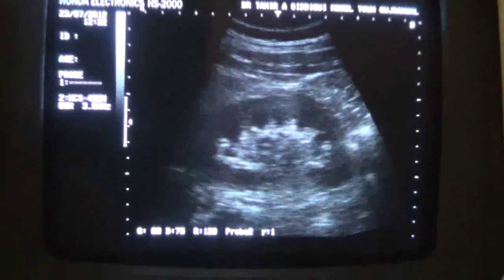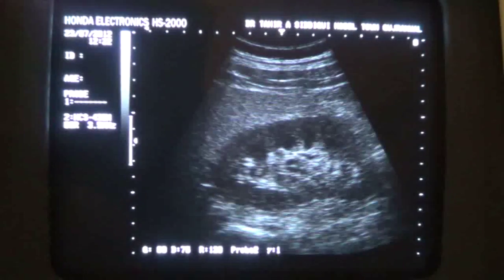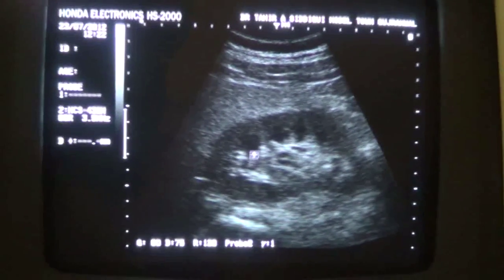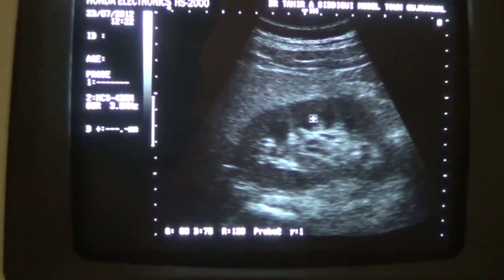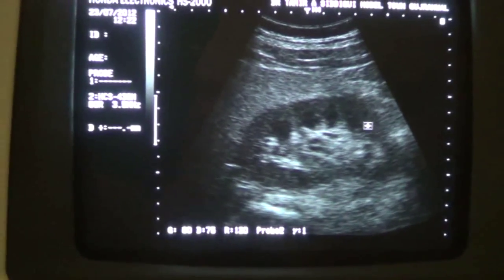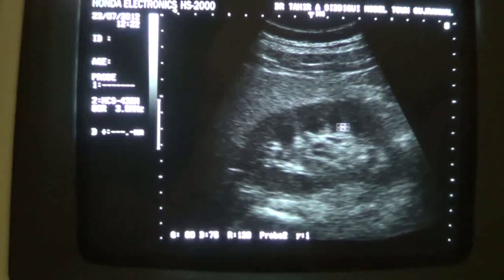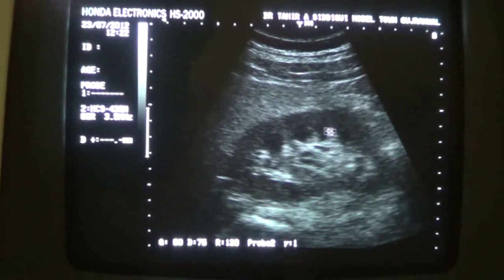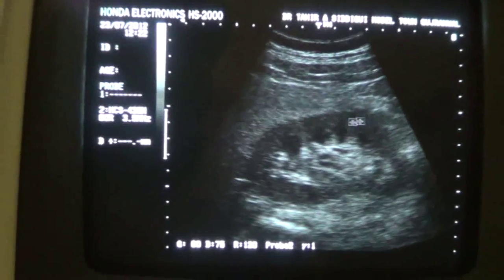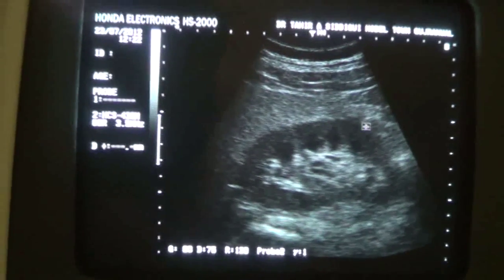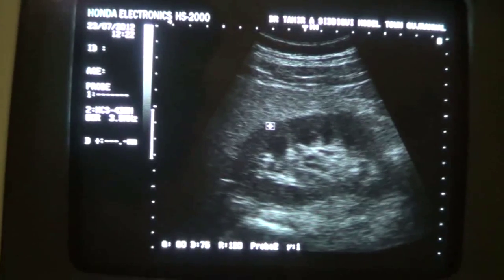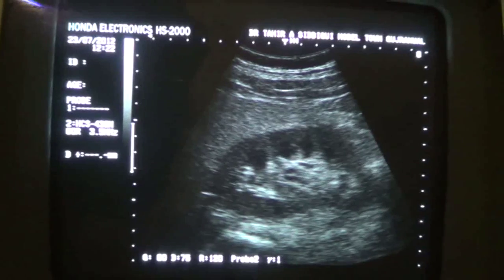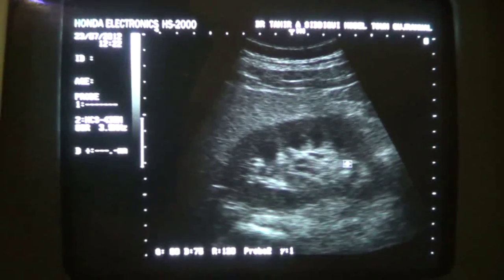This is the right kidney showing the prominence of the renal pyramids — not dilation. There is significant prominence of the medullary pyramids with the cortex normal and the outer surface normal. Thickness of the parenchyma is normal, and cortical medullary distinction is normal. This is the central sinus hyperechoic complex.